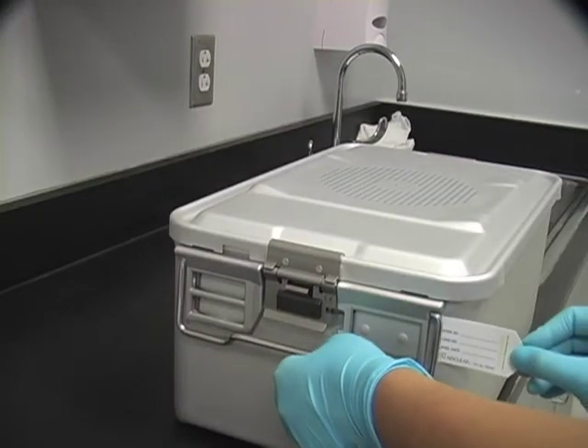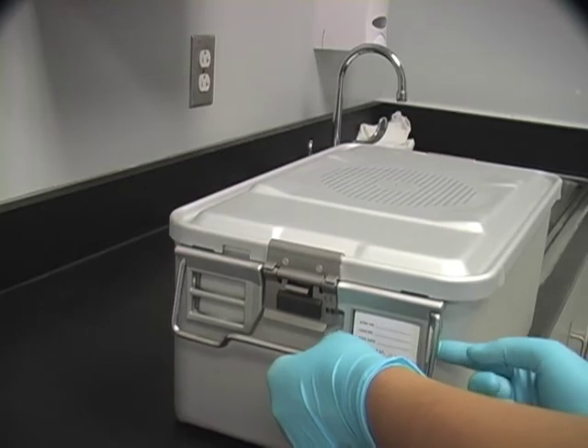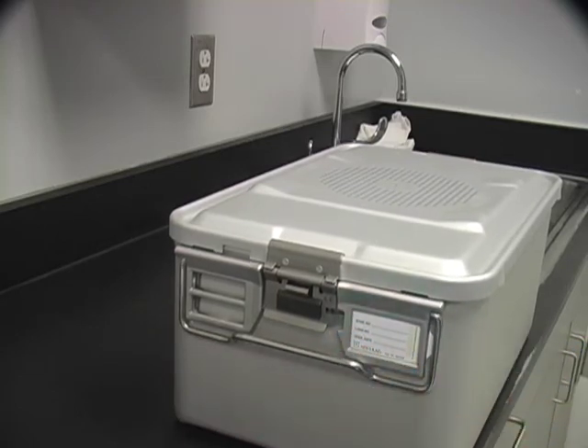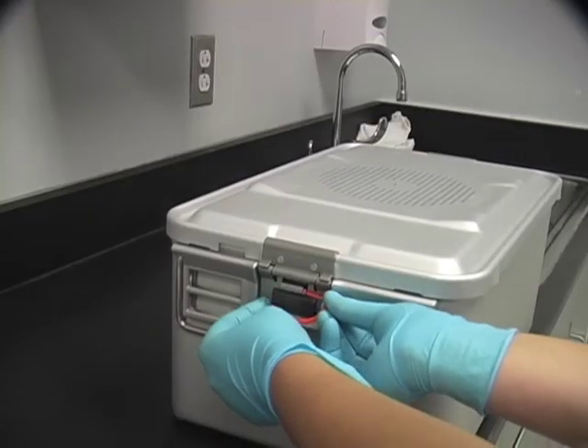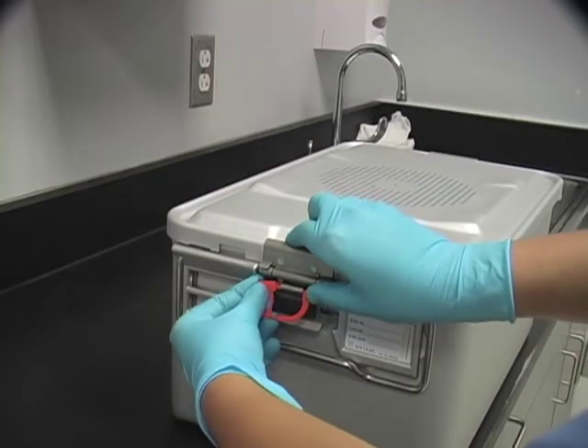Select the appropriate indicator card and insert into the holding bracket on the outside of the container. A tab at one end of the indicator card will facilitate insertion and removal. Insert the appropriate tamper-proof seal into the locking channel on each end, then secure and lock the seals.